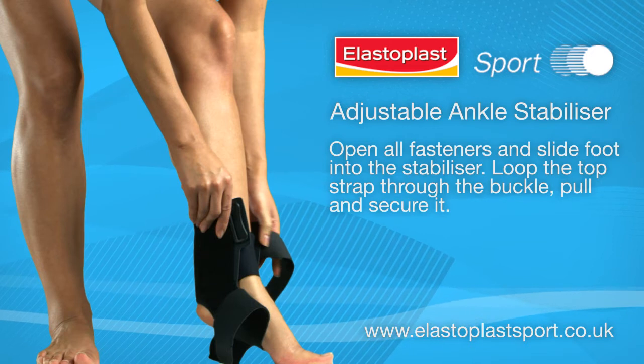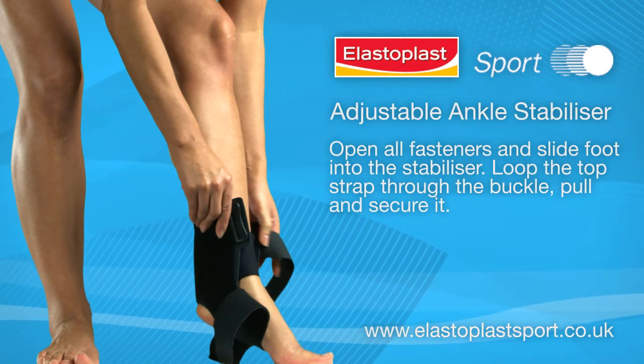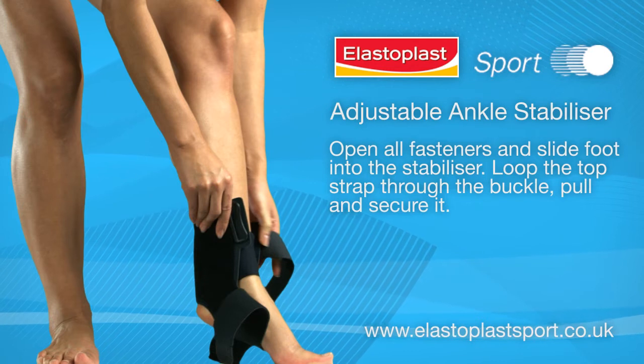Open all fasteners and slide foot into the stabilizer. Loop the top strap through the buckle, pull and secure it.